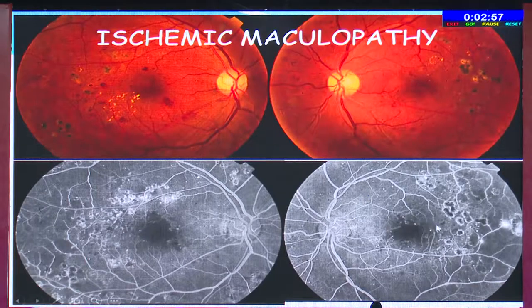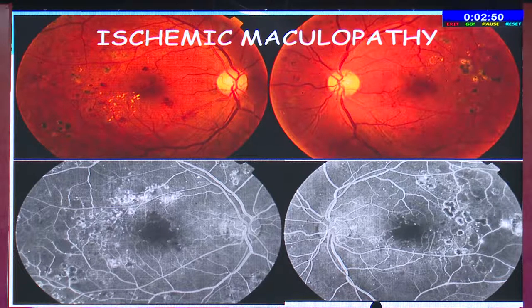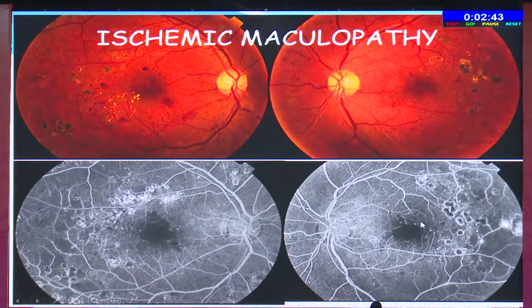Before starting treatment for diabetic macular edema, it is important to look for any point of ischemia in the macula. As seen here, the foveal avascular zone is increased in size and irregular — this is a sign of ischemic macula.